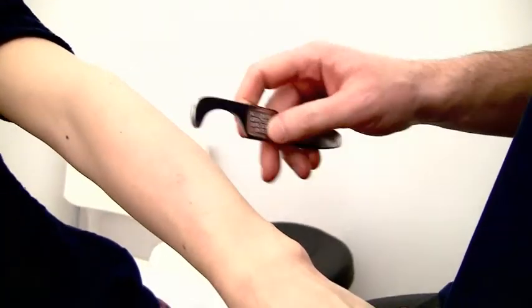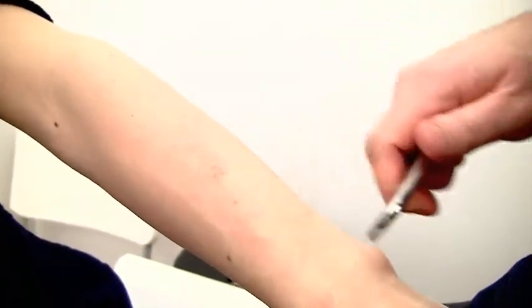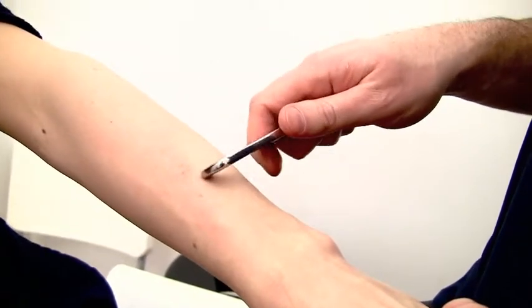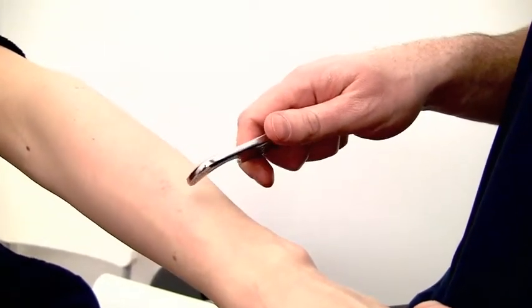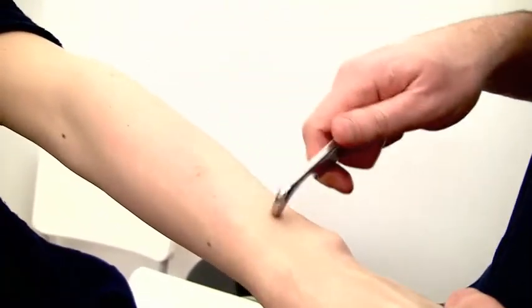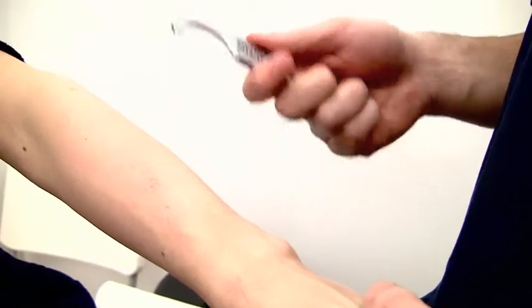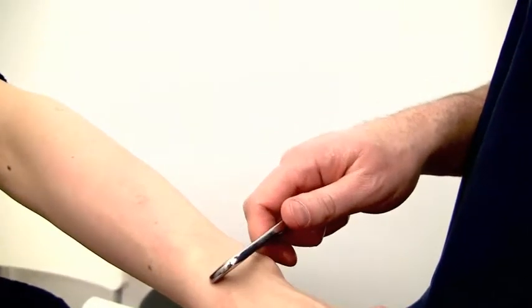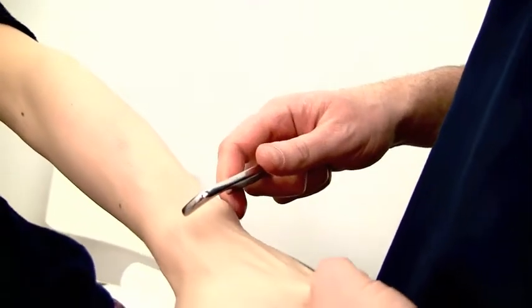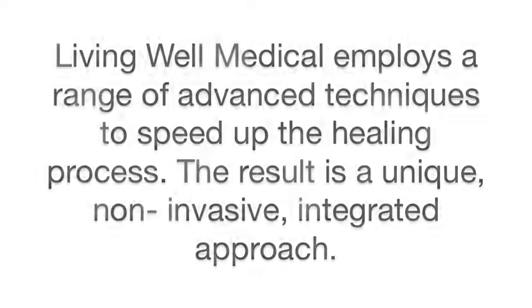Some of the responses you get are inflammatory changes. Specifically, you get petechiae right there. When that comes to the surface, those tend to be more of the trouble areas, and it's normal to see that when you're doing Graston. When the tissue is really bad, you'll see that the entire tissue will be covered, and it gets really red and inflamed in that region, which for Graston's sake is a good thing, because that means we're working the right tissue, and the inflammatory response will actually cause healing to occur at a much faster rate.